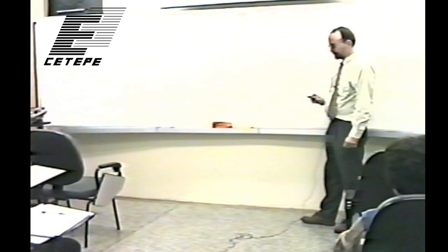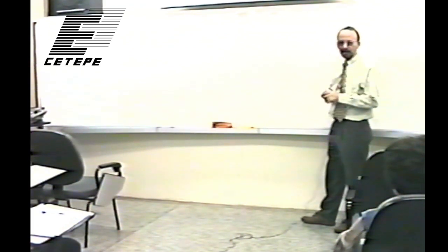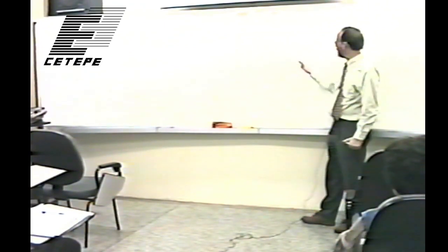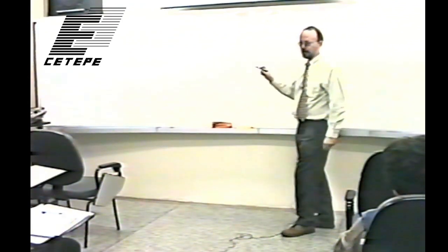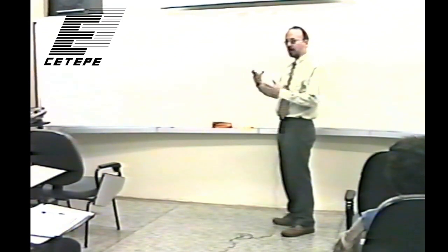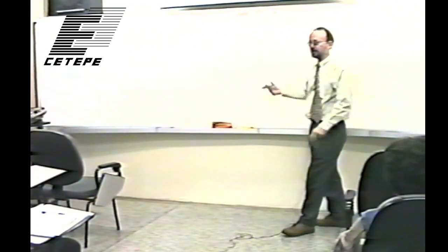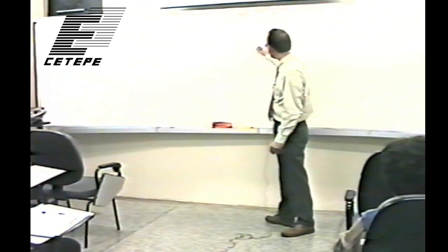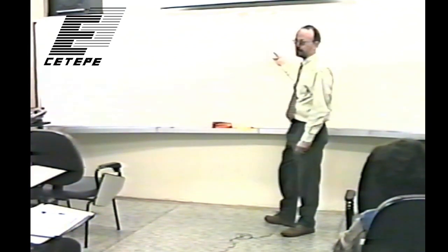And depending on how much time we have this week, I do have some slides that talk about these devices a bit. But instead of being based on this 3-electrode kind of system, the electron charge is generated in a very similar way as in a silicon crystal, but the readout is different, involving TFTs, which are thin film transistors.